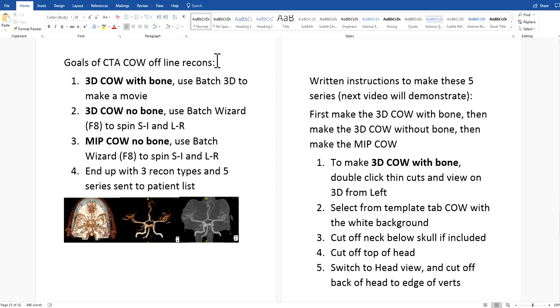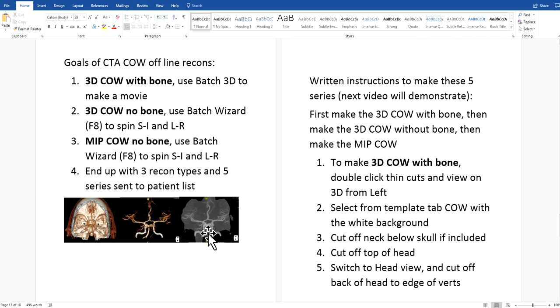So what are the goals of our CTA COW recons? We're going to make a 3D COW with bone using the batch 3D tool to make a movie. Then a 3D COW without bone using the batch wizard, or F8, spinning superior to inferior from the anterior view and then left to right from the anterior view — two series. Then a MIP COW, also using the batch wizard, spinning both ways again — two more series. So three recon types — 3D COW with bone, 3D COW no bone, and MIP COW no bone — and five total series.